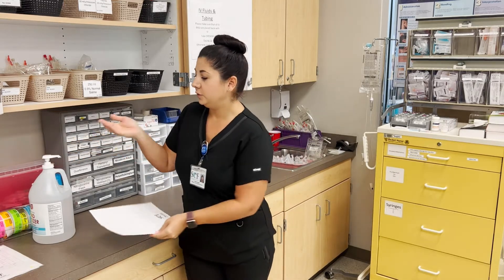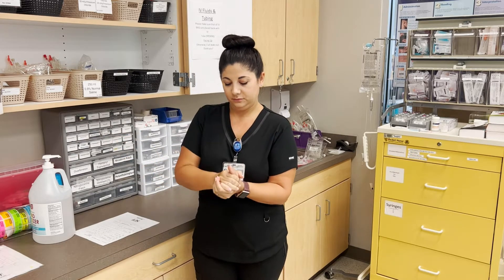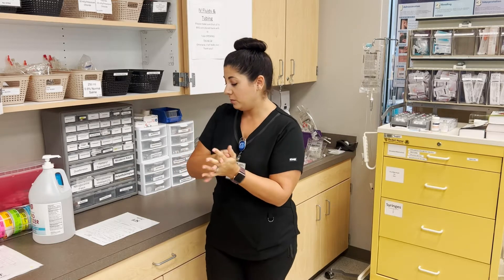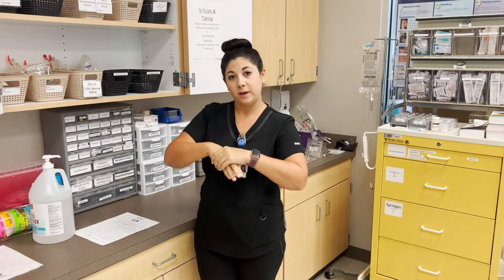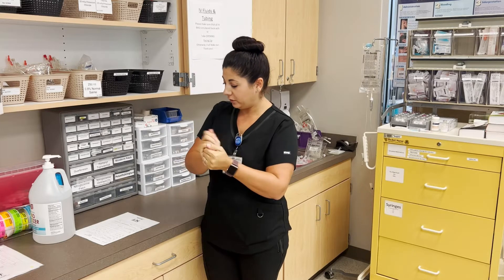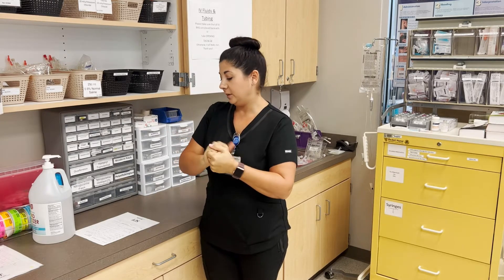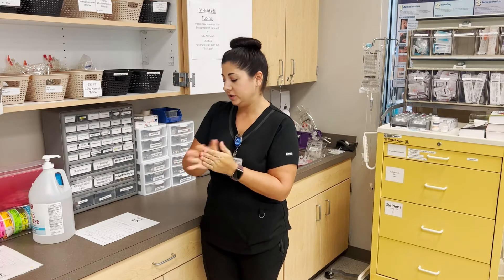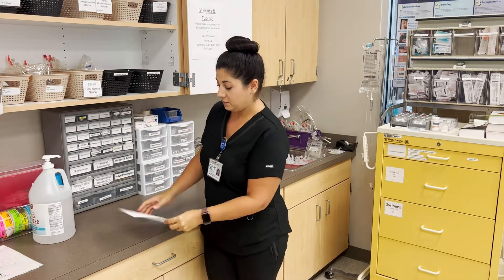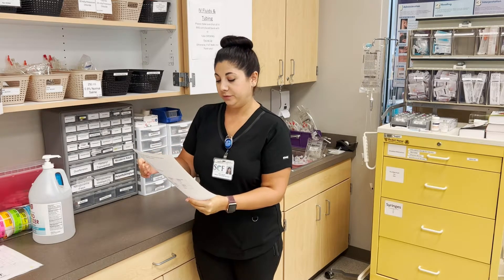I'm going to wash my hands and then look at my MAR, making sure that I have the correct patient — their name and their date of birth are on there and are correct. I'm looking at their allergies to ensure that I'm not giving anything that they might be allergic to. I am looking at the time and determining which of these medications I need to give.